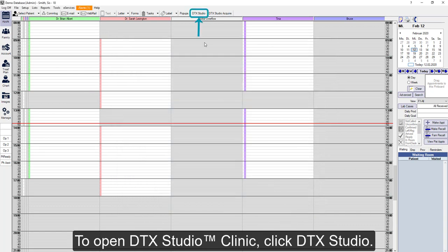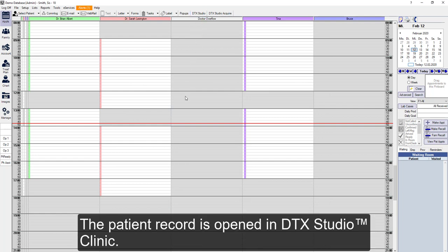To open Clinic, click DTX Studio. Now the patient is being opened or created in DTX Studio Clinic.